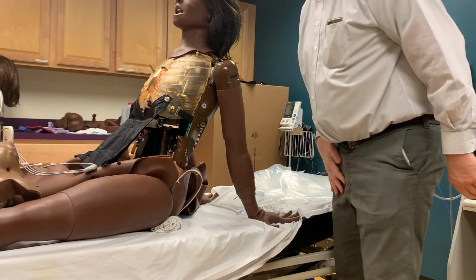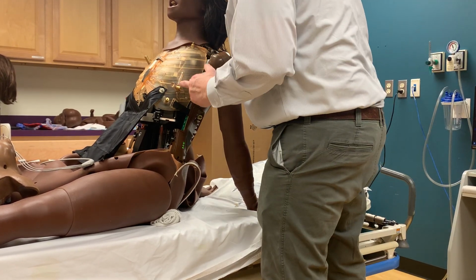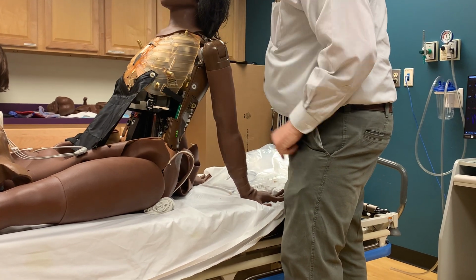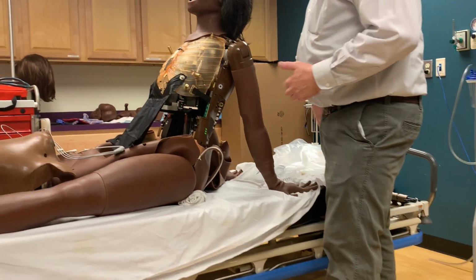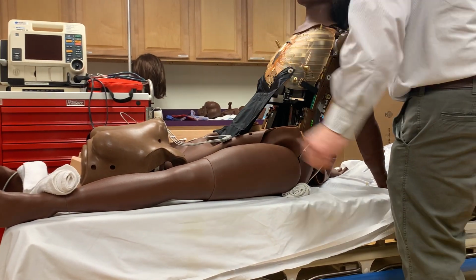And then it clicks in place like that, okay? Now, you notice her chest is rising and falling. Underneath there are little pistons that are pushing it up. These elastic bands allow the recoil of her chest. If we wanted to show unilateral motion, this is how it looks mechanically in her.